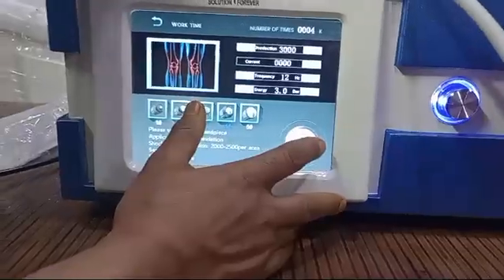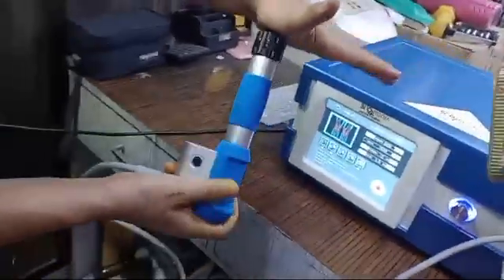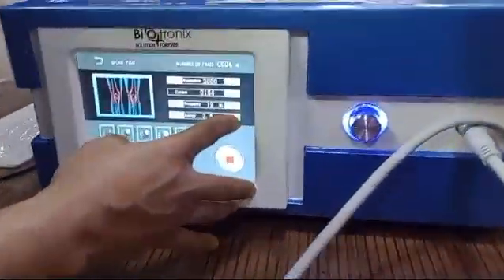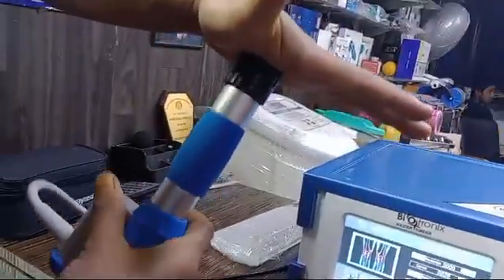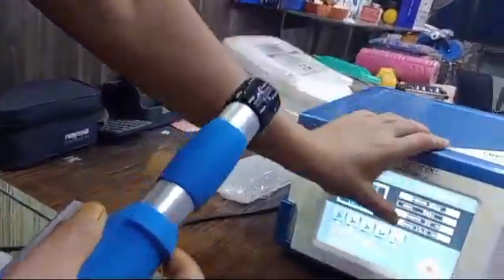Now I will start it by pressing here. The device is ready. When I press, it will start giving shockwave. You can see it's 3 bar energy. If I increase the energy, you can see, I increase it to 10. I can vary the frequency accordingly. Frequency increase, and if I decrease it, it's quite high, so I am decreasing it.